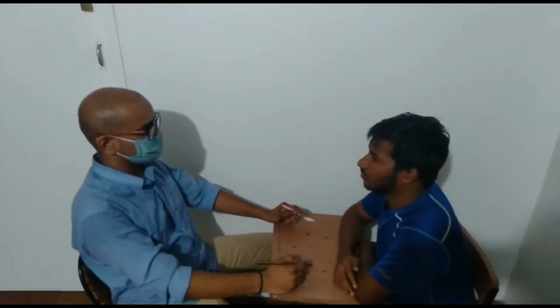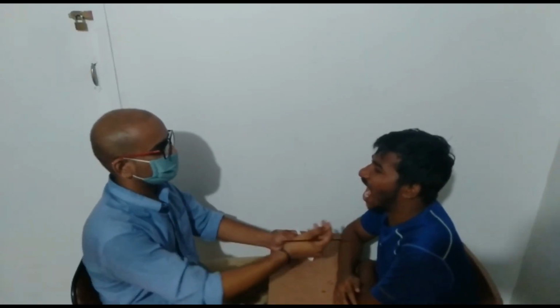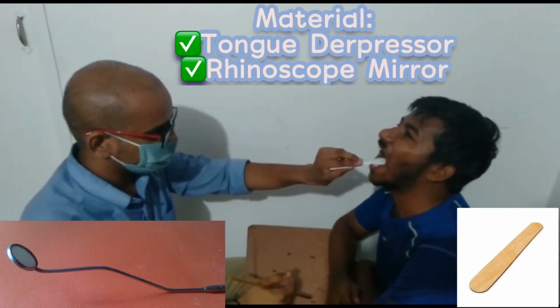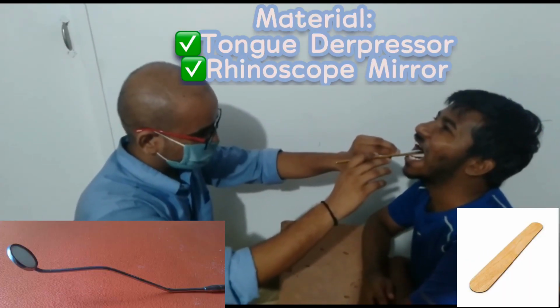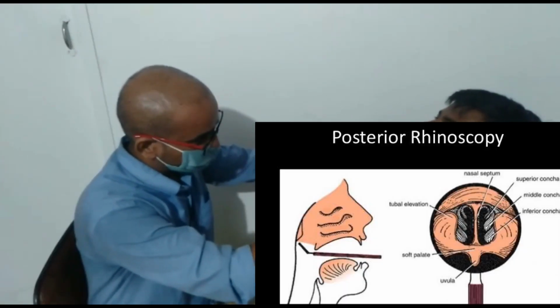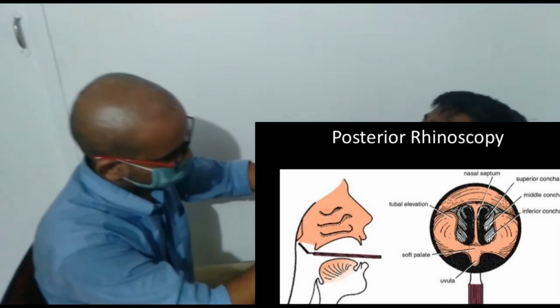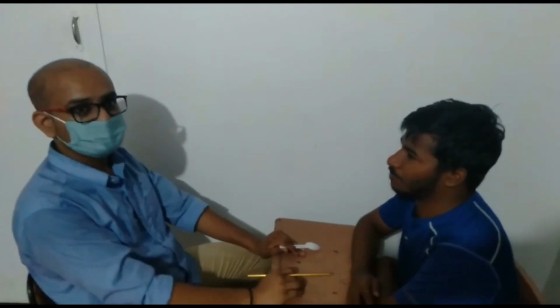I'm going to do a physical examination on you. Is it okay for you? Yeah, it's okay. You can continue. Can you just open your mouth? Make your head up, chin up. This is the tongue depressor, which is used to depress the tongue. And this is the mirror, with which we are going to see whether there are any adenoids, larynx and nasopharynx. Okay, thank you. And this is the procedure of posterior rhinoscopy.